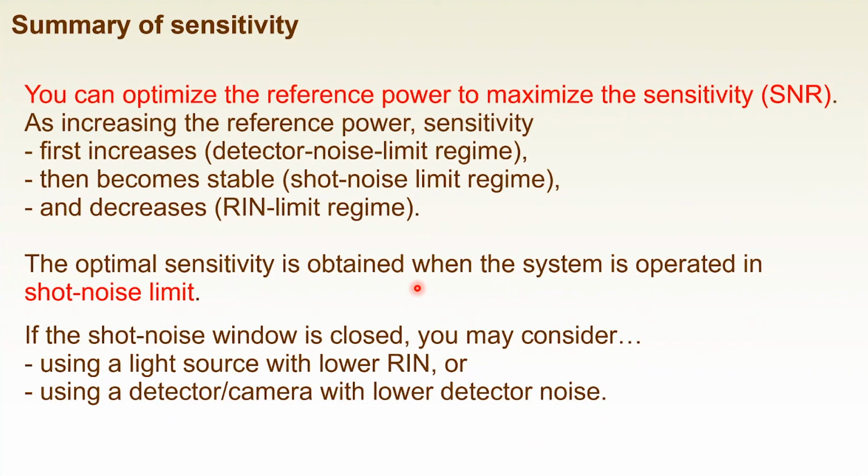If the shot noise window is closed, you may consider using a light source with lower RIN, or using a detector or camera with lower detection noise.